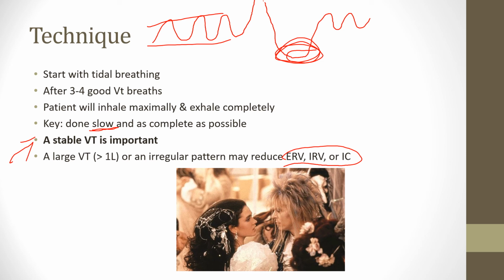And like I said, most of the machines too will tell you if the patient has reached that stable tidal volume. So you're going to have some digital help nowadays. Thank goodness. And then hopefully we get to at least play with some of the machines at the lab. We'll see how that goes, but it'll be fun for us to actually see some of this. Like I said, please go look at some of the complete PFT videos if you can on the Peabody website.